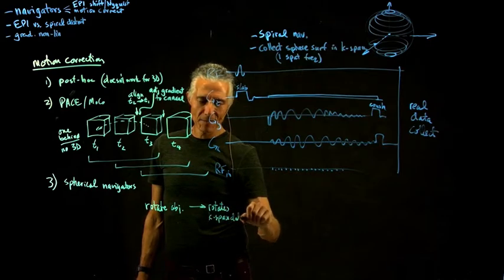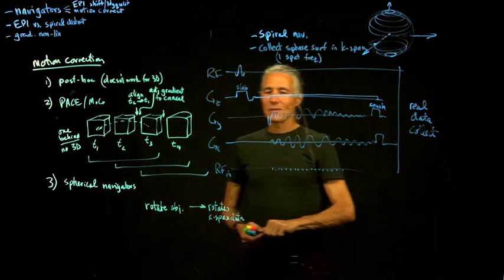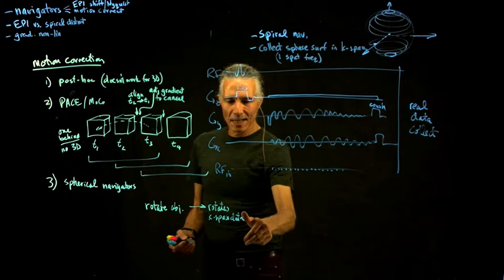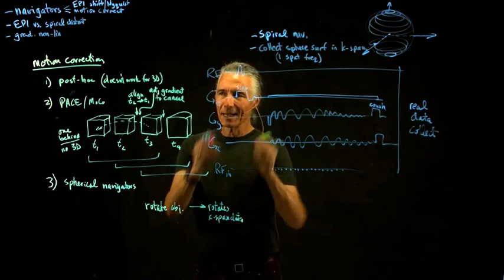So that's sort of interesting. A rotation actually just physically rotates the K-space data around.